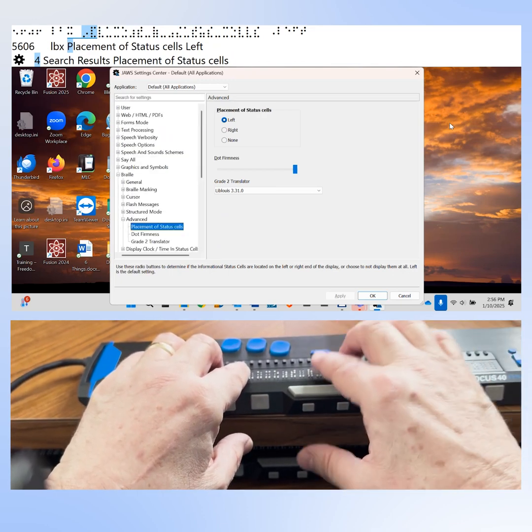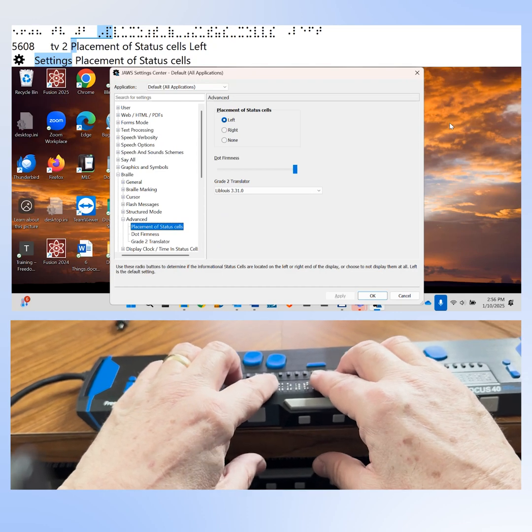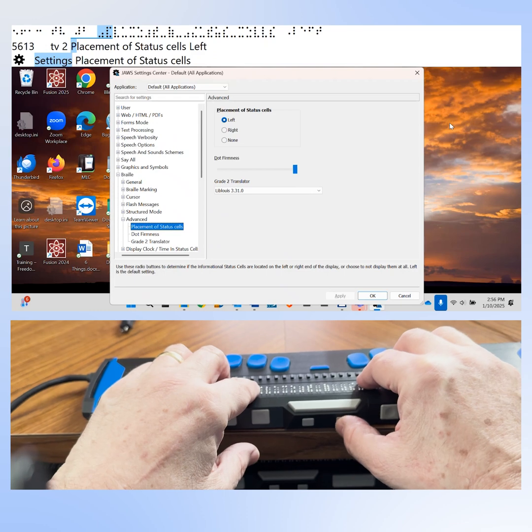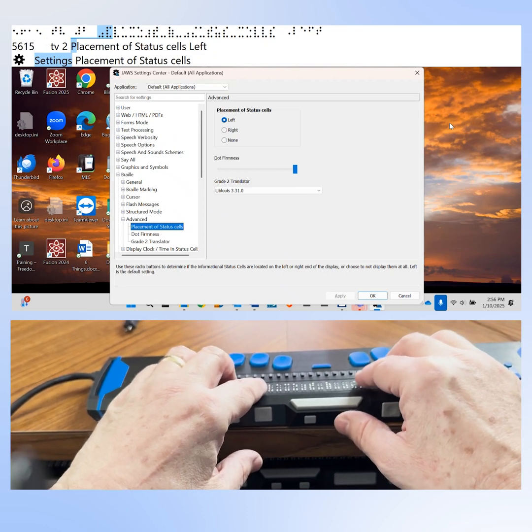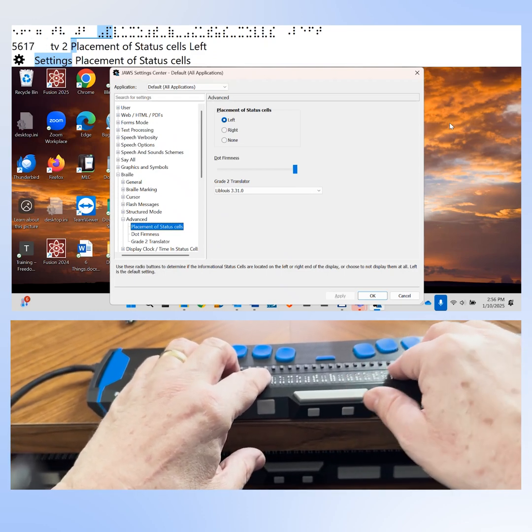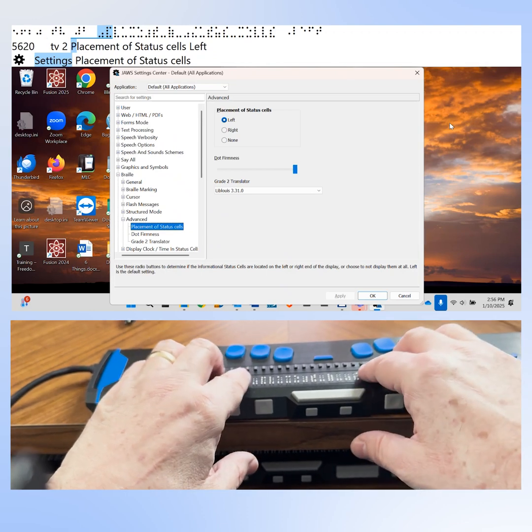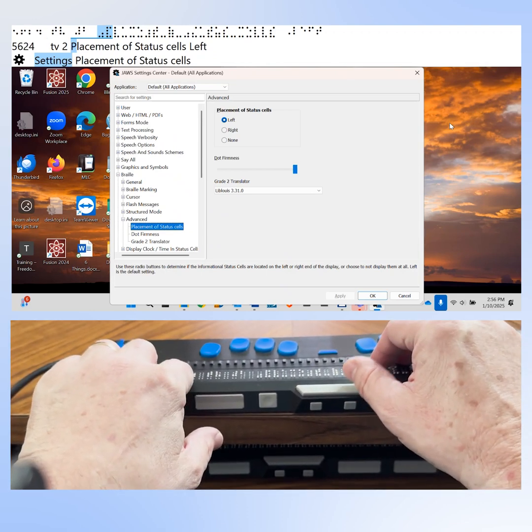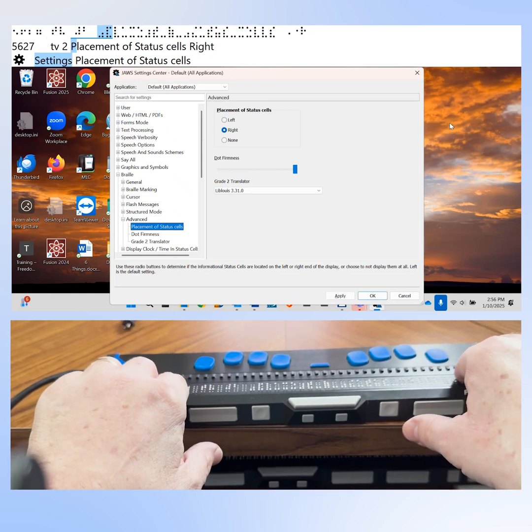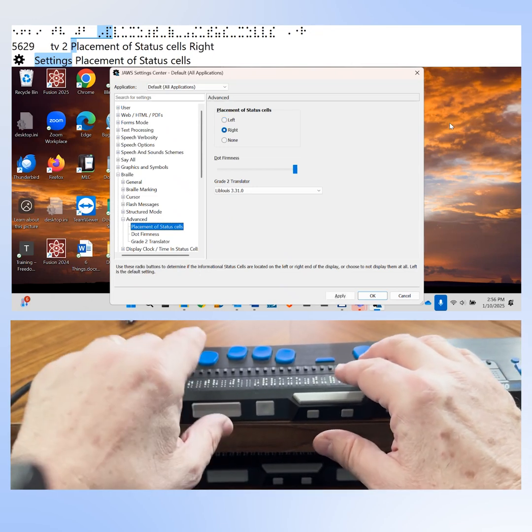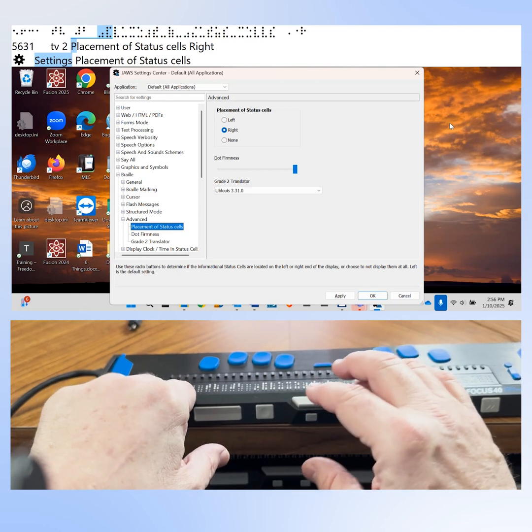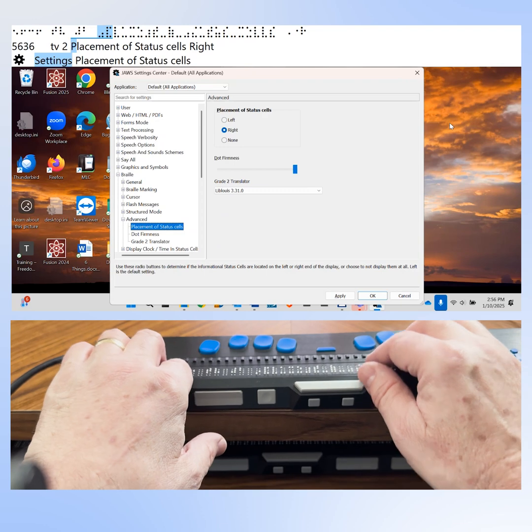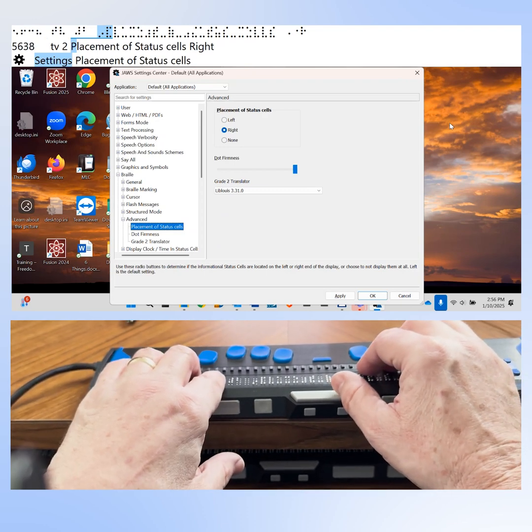We'll press Enter to move focus to that setting in the tree view. Placement of status cells is currently set to left. Focus has now moved to that setting and you can cycle through your choices by pressing the space bar. Right now status cells are set at the left end of my braille display. Pressing space moves them to the right end. We are now selected to show the status cells at the right of the braille display.